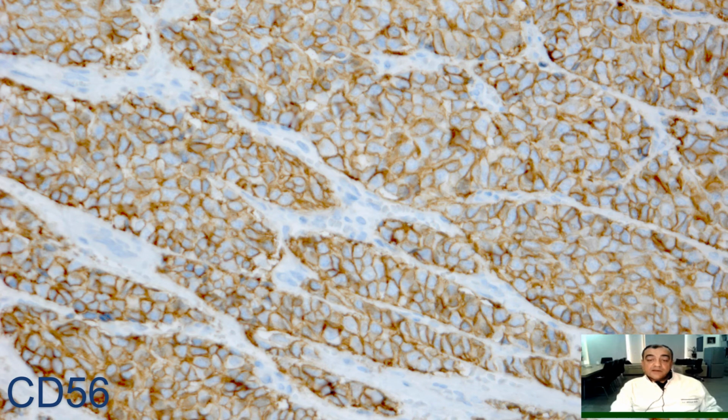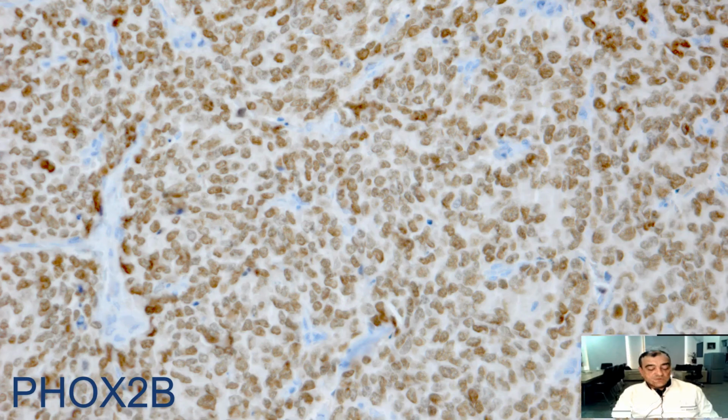CD56: it is a highly characteristic feature that the neuroblastic cells have very intense membranous staining with CD56, and from this point pathologists start to think about the possibility of neuroblastoma. And then we include a very important antibody, PHOX2B.